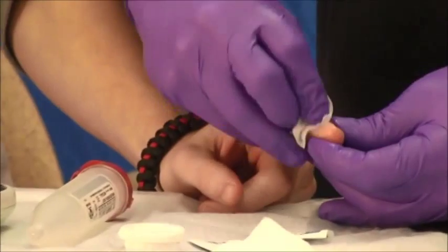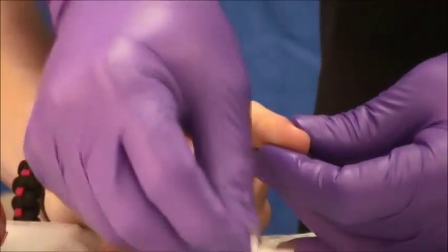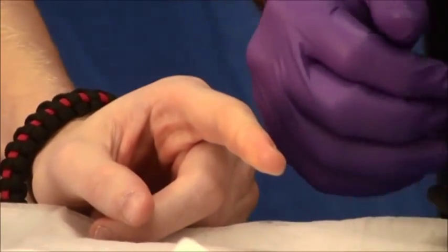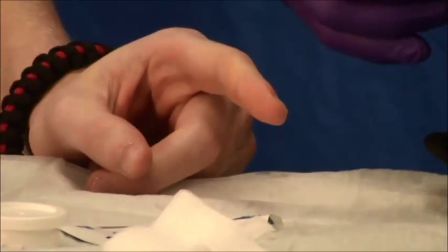Wipe the site vigorously so as to get all the dirt off and allow it to air dry. Never blow on the patient's finger or wave your hand to get the alcohol to evaporate.